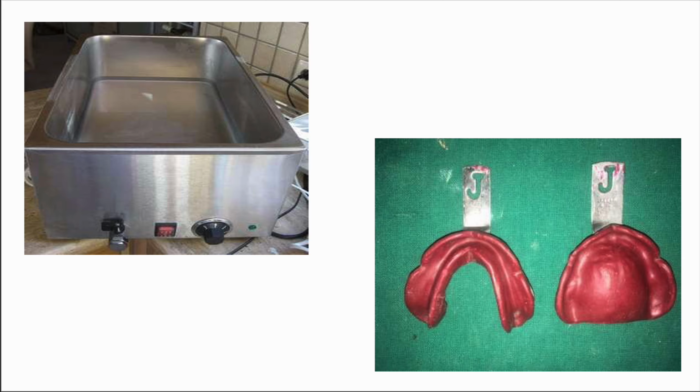This is the hot water bath that we use for kneading the impression compound to soften it. The right side picture shows the first one being the lower mandibular impression and the next one is the maxillary impression obtained using the impression compound in a non-perforated stock tray.